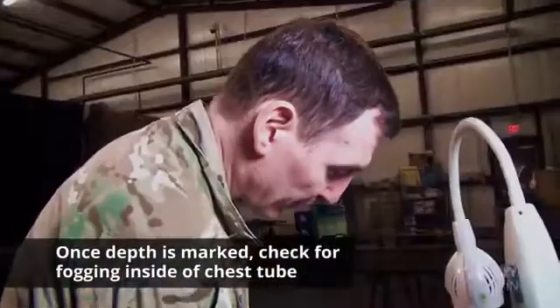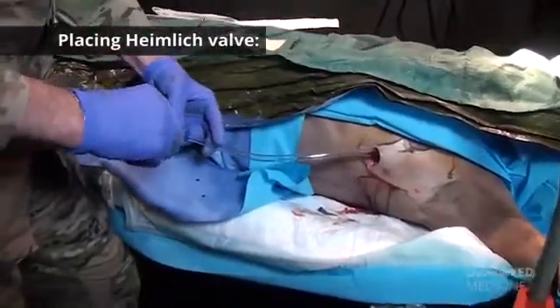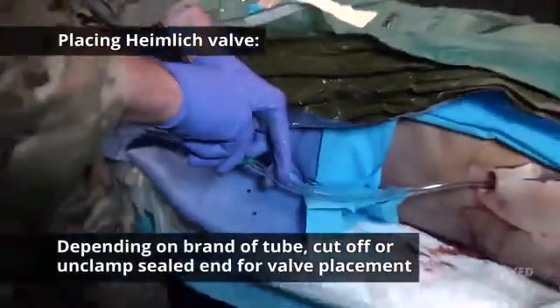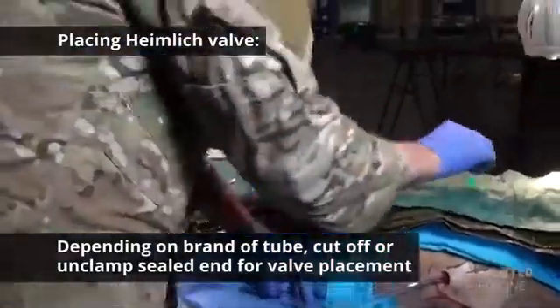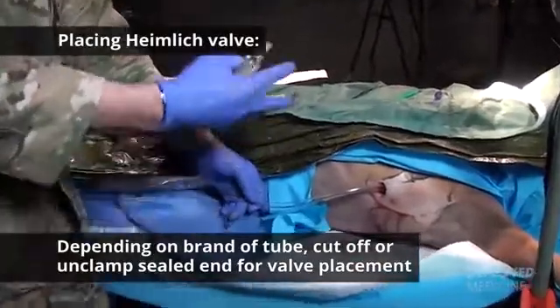Once I've marked the depth of my chest tube, I'm going to look for fogging inside of the chest tube, and then I need to put on my Heimlich valve. Depending on your branded chest tube, you may need to cut off the end. Other times you may just need to undo the clamp.